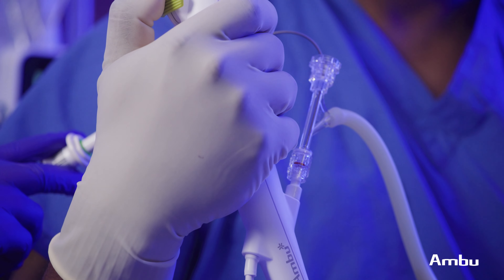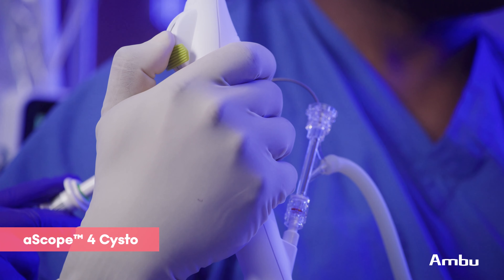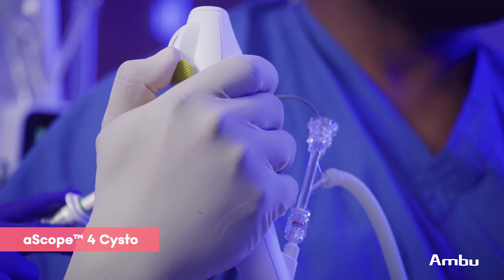Hi, my name is Obi Aquena. I am a kidney transplant surgeon and a urologist. I am from Toledo, Ohio. Today I will be demonstrating the utility of Ambu's single-use ASCOPE 4 Cysto to remove a kidney transplant stent.